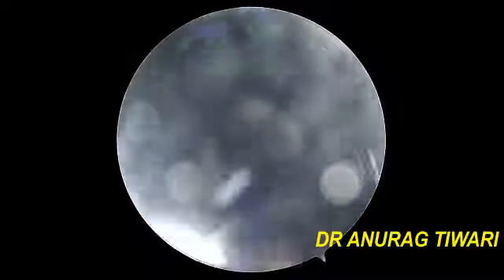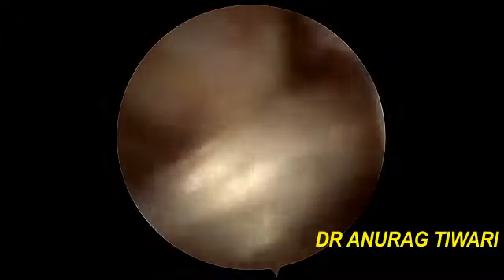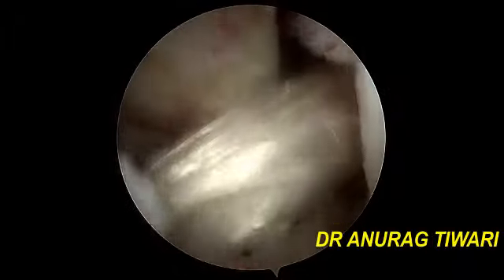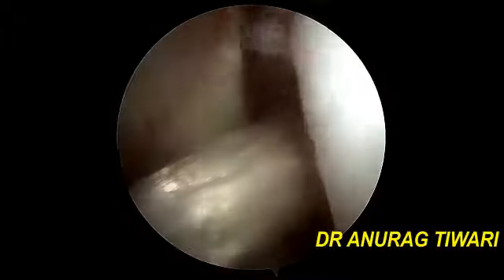Now we remove the camera, we do the cycling, and we will fix the graft on the tibial side with suture disc. After fixation on the tibial side with the suture disc, we can again pull the graft onto the femoral side using the adjustable threads.